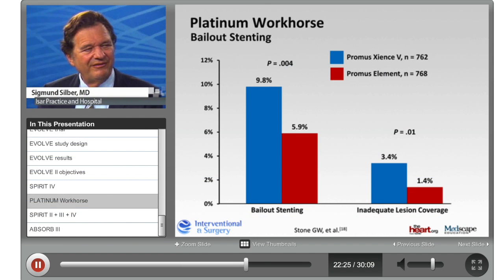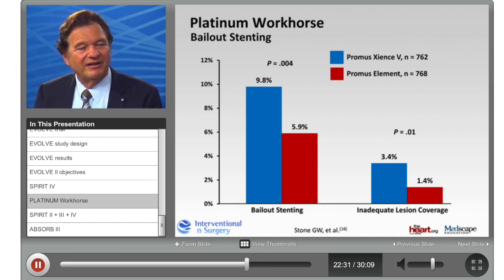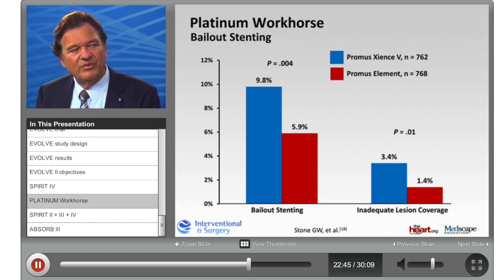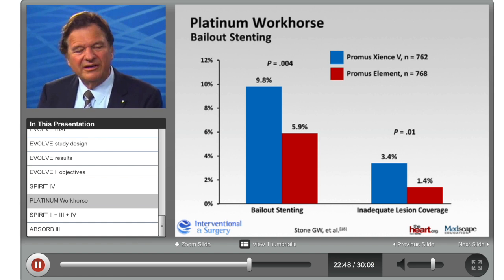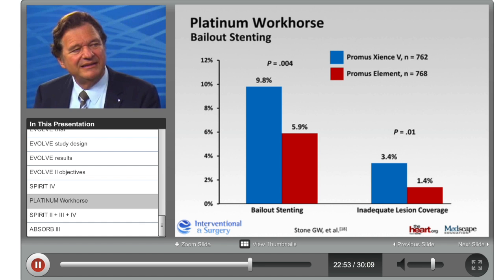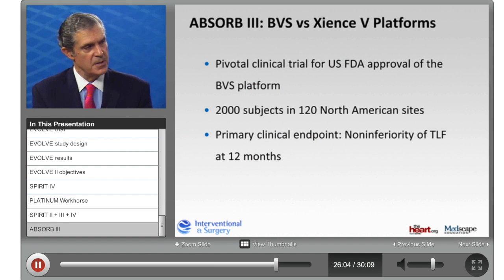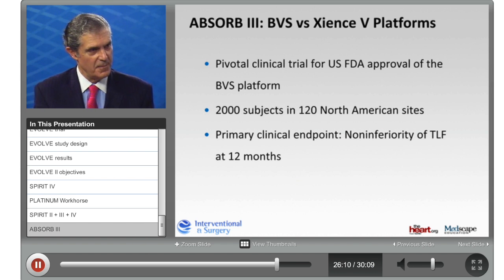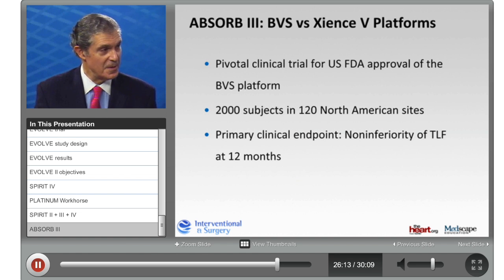We are shifting what we emphasize. In the previous days, we talked about late safety, not efficacy. Efficacy was okay, but late safety was the issue. Now we are switching. We are talking no more about late safety; we're talking more about late efficacy. So I guess this is what we would expect from the newer stents, because, as you said, with the newer generation durable polymer, the very late stent thrombosis is not an issue anymore. But the very late efficacy would be very, very interesting to see. There are about 8 reasons why one would hypothesize that a completely bioabsorbable platform might have an advantage. Oh, absolutely. But until proven. Yeah, it has to be proven.